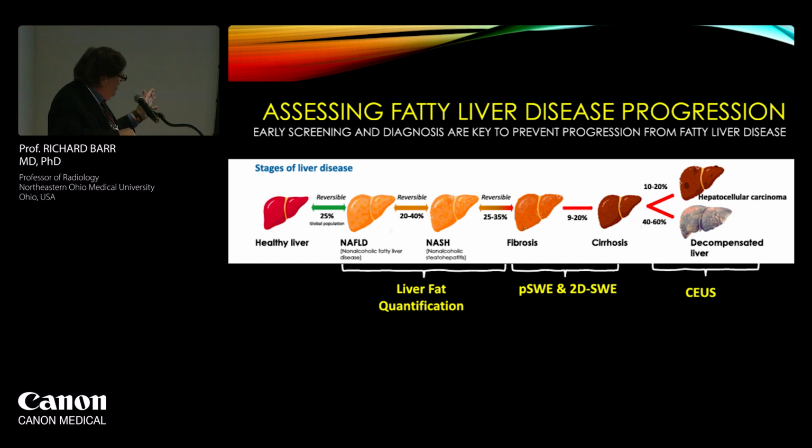I just want to point out that ultrasound is really the modality of choice for looking at chronic liver disease because it's widely available, it's inexpensive, and you can notice we have a healthy liver, go to NAFLD, to NASH, fibrosis, cirrhosis, and again, we now have fat quantification to make the diagnosis of NAFLD. We've got point shear wave 2D and maybe dispersion slope that's going to help us decide about NASH. Again, shear wave is going to help us with fibrosis, cirrhosis, and then obviously, we've got ultrasound contrast that we can look at focal liver lesions.